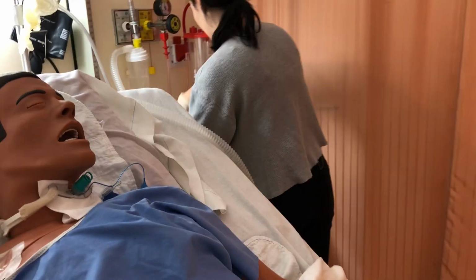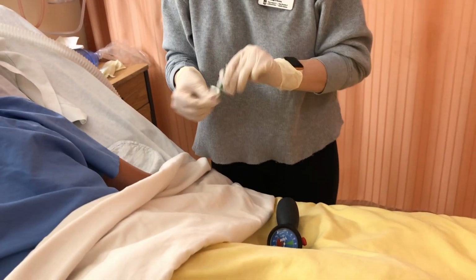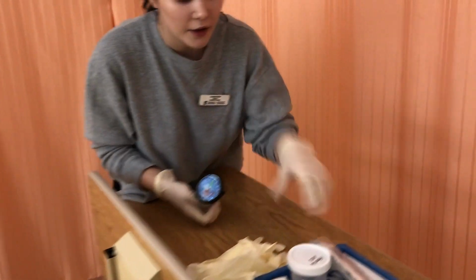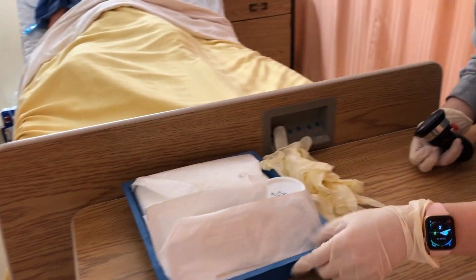Okay, so that's good. Now I'm going to be checking cuff pressure. I'm just going to get another alcohol swab.